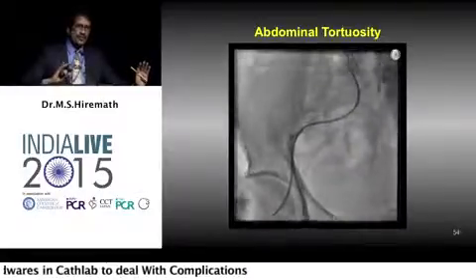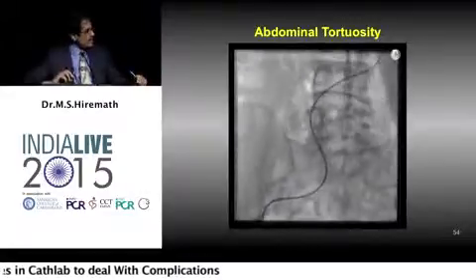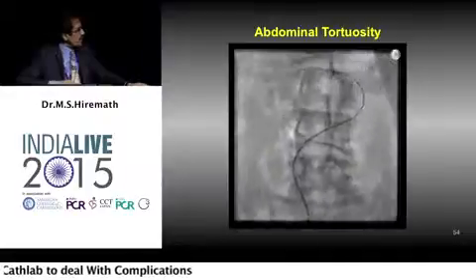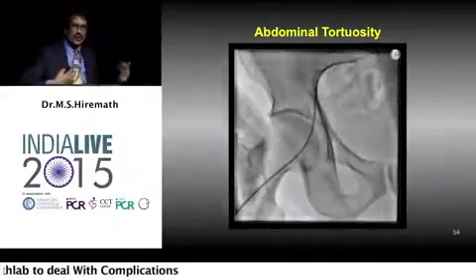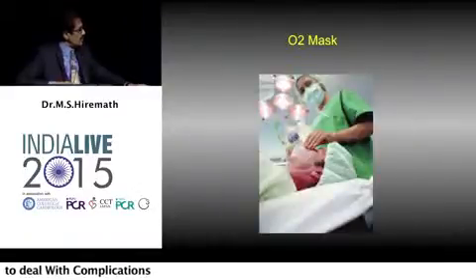So whenever you think you are dealing with a complex situation, take this long catheter. It increases your pushability extensively. And even if the aorta is slightly opened up, you can use these kinds of long sheaths.